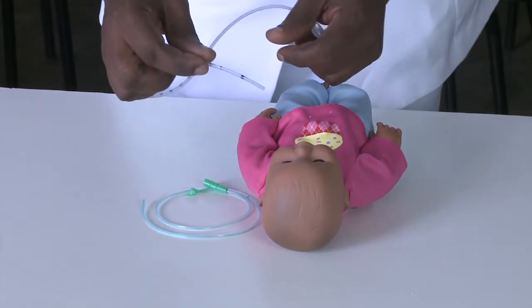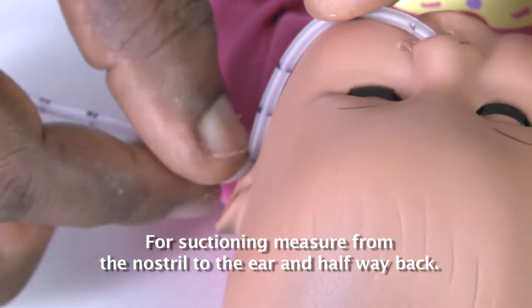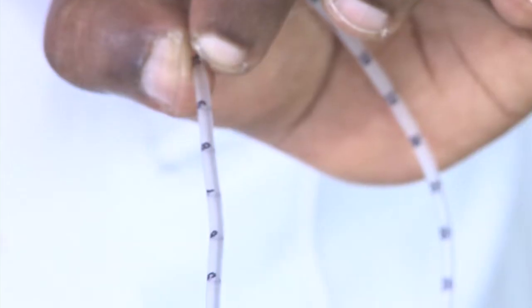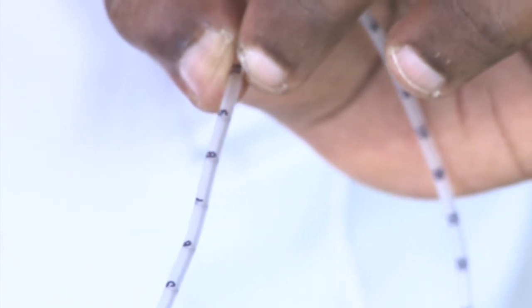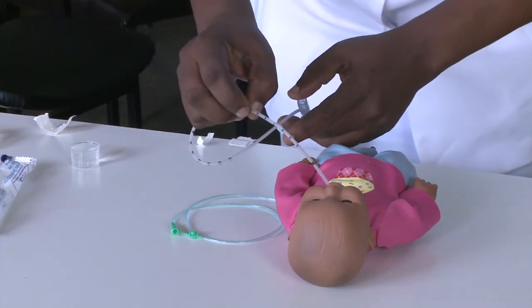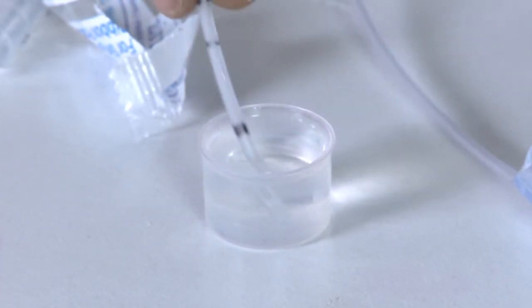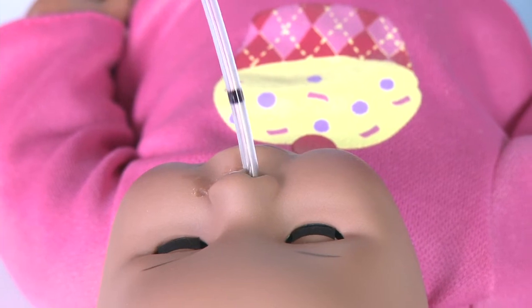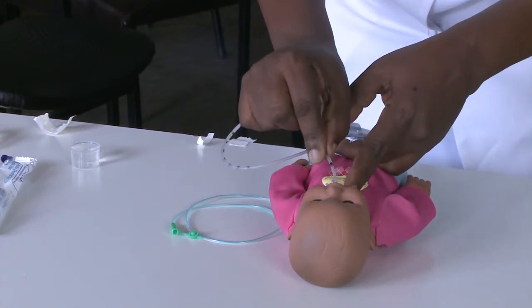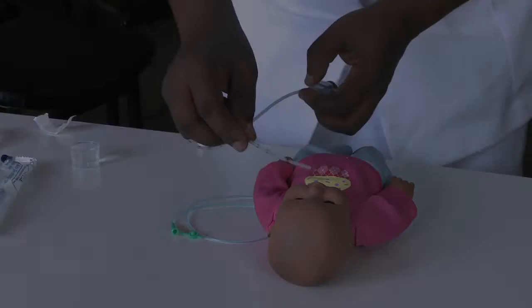I have my suction tube here. First, I'm going to measure from the nostril to the ear, then halfway. This gives me the length that will go inside the nostril when suctioning. I'll start suctioning — this tube is connected to the suction machine. I'll start in the nose. Usually you'll have a bowl of water nearby to clear the tube. Once I know the nose is clear, I'll go into the mouth and suction as well, up to the measured length. Now I know that the airway is clear.